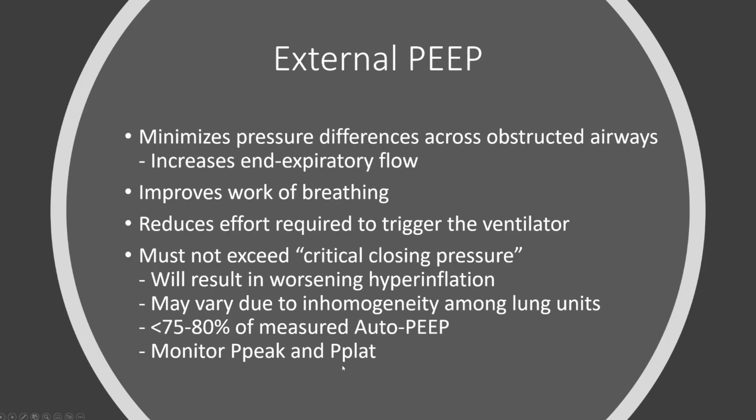At the same time, ventilation is a dynamic process, and you still want to monitor your peak and your plateau pressures. If you've increased your PEEP by 3 or 4, and your plateau pressure rises in turn, you want to see it eventually fall, or you want to see it stay the same. Otherwise, if your peak and your plateau are rising in concert, then it could very well be that you're not making the difference that you wanted to make, and adding PEEP to the system didn't lead to the desired result.